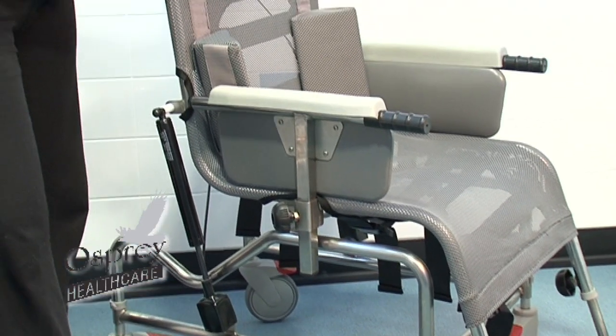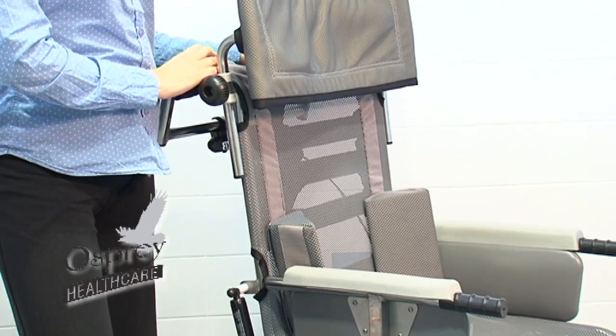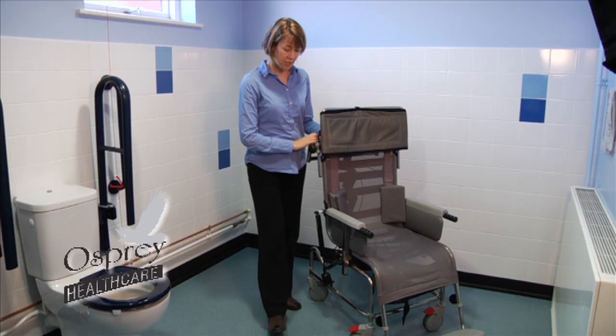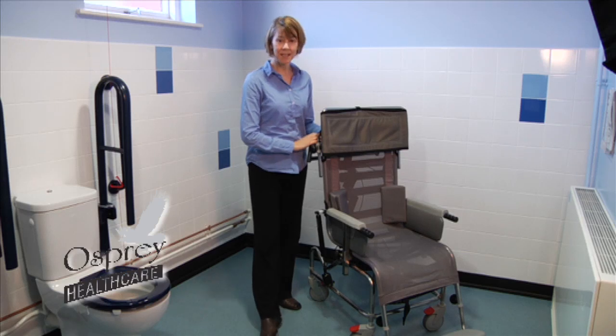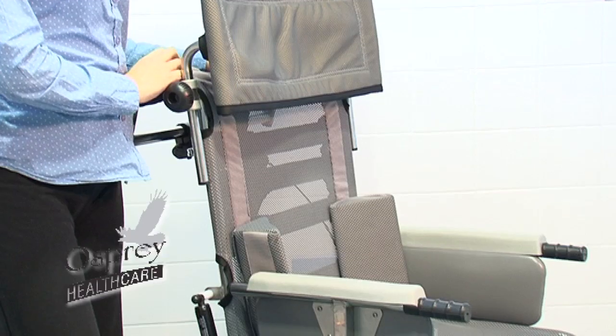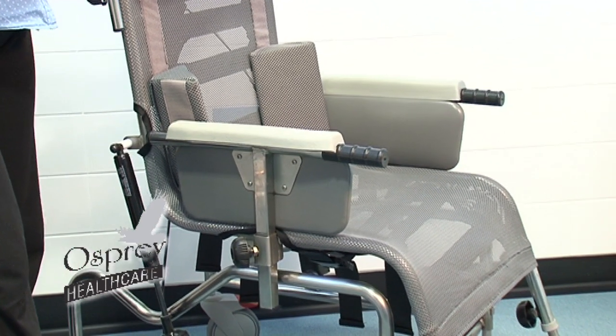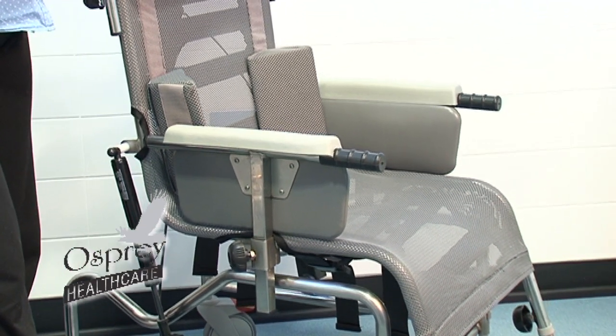This cradle comes with a 15-year frame warranty and a two-year parts warranty, and is available in three sizes: infant, paediatric, and adult sizes. The safe working load of this shower cradle is 150 kilograms or 23 stone, and it's available through Osprey Healthcare and also their dealer network.